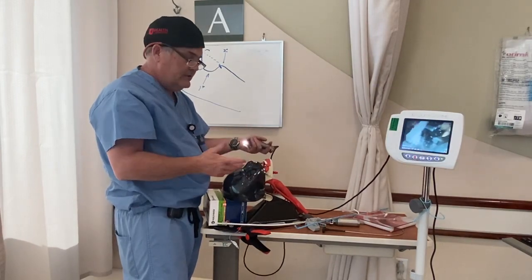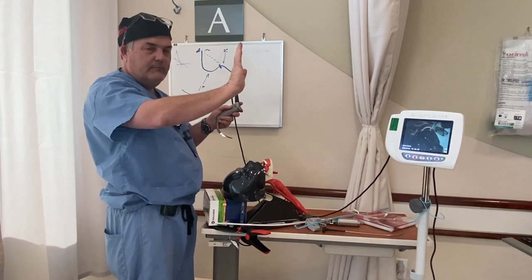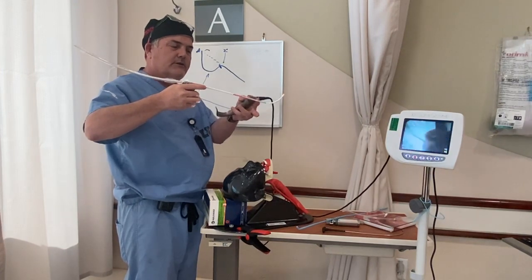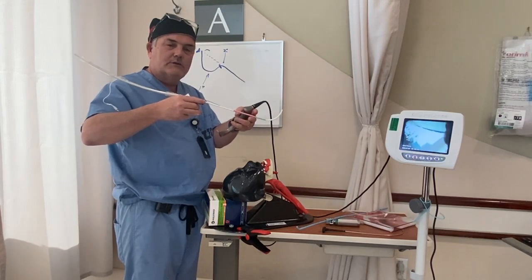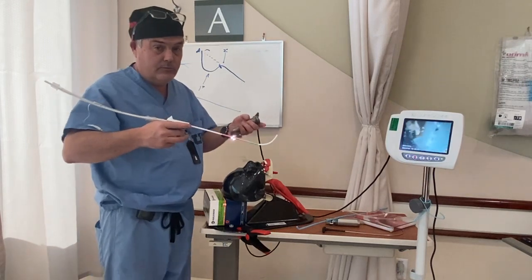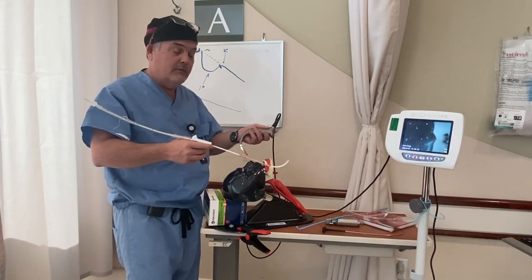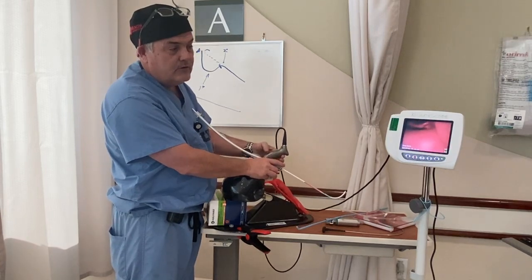The third part uses a hyperangulated blade with a dynamic introducer. Dynamic introducers can move the tip both anteriorly and posteriorly — this is a steerable introducer with a flexible shaft, so wherever the tip is steered the shaft can follow in a serpentine shape. It can actively navigate posteriorly and anteriorly. You can accomplish the same thing with a fiber optic bronchoscope — even an old one without visualization but that can be steered will give students the same experience.